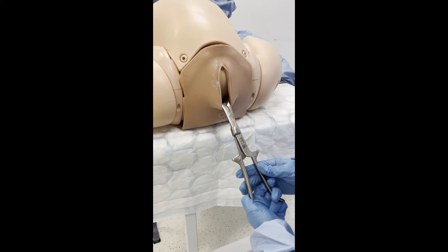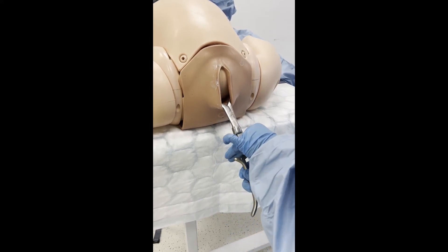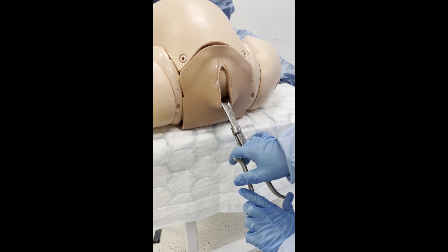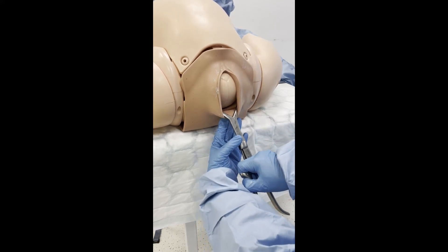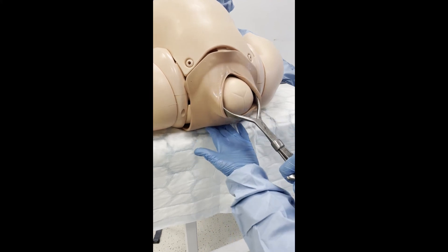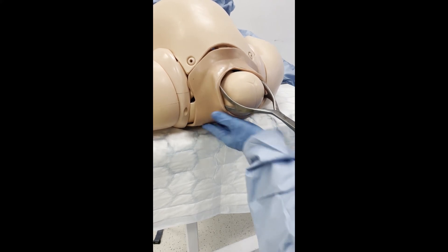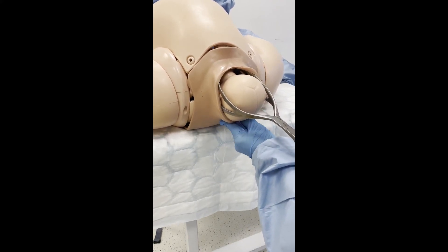The assistant will palpate for a contraction. When a contraction is present, apply traction in the direction to follow the pelvic curve, as with non-rotational forceps. Support the perineum and perform an episiotomy when the fetal head is crowning. Upon delivery of the fetal head, remove the Keelan's forceps. Finish by delivering the baby.